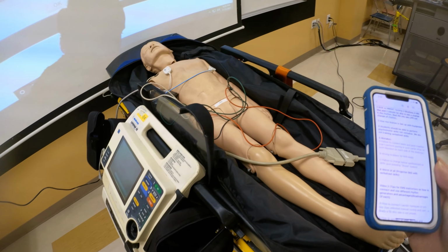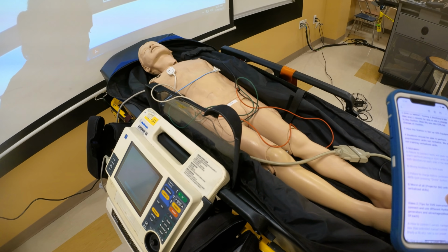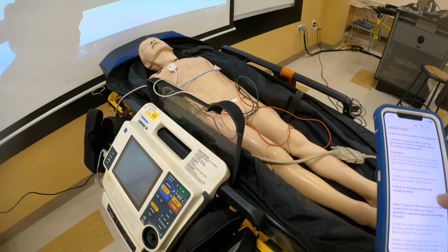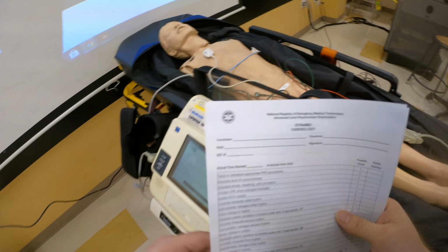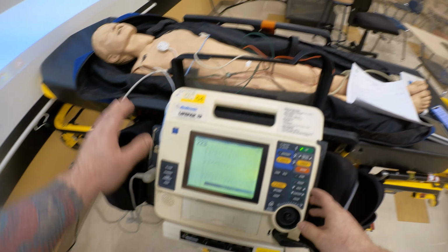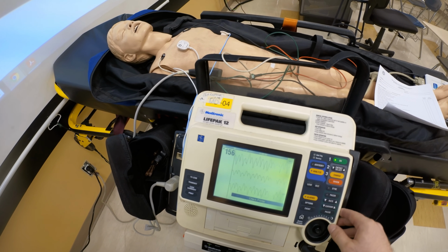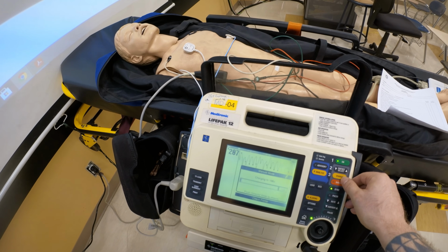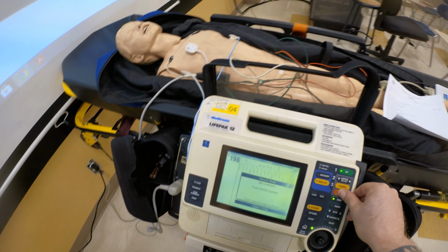And finally, once we've gone over this, they're here to perform psychomotor skills. I want to talk about the common mistakes that students make when I'm testing the station. The first mistake they make is they tend to place the quick pads, but they do not place the limb leads. So let me show you if I wanted to synchronize cardiovert. I put on sync, and it's functional, I select my energies, I charge, and I'm able to deliver the shock.